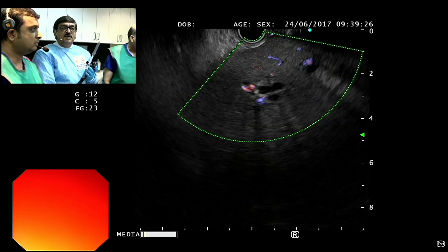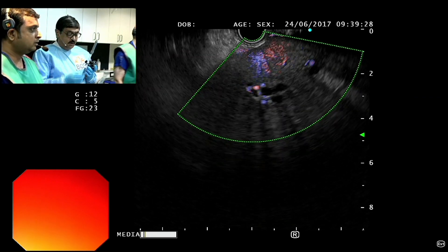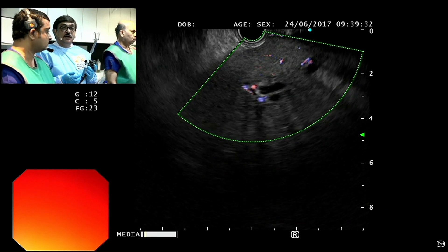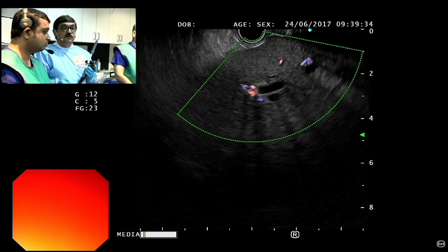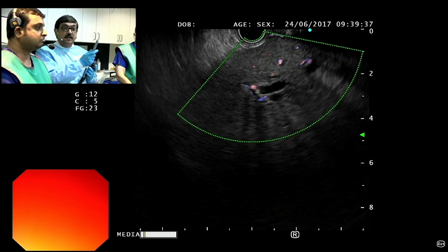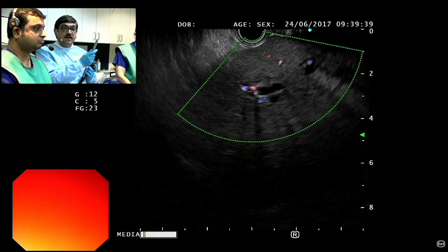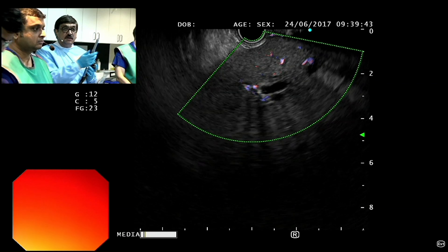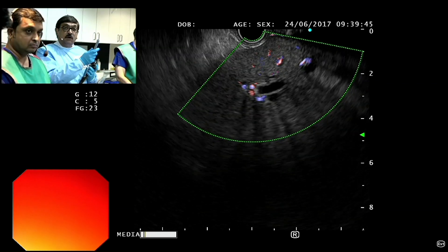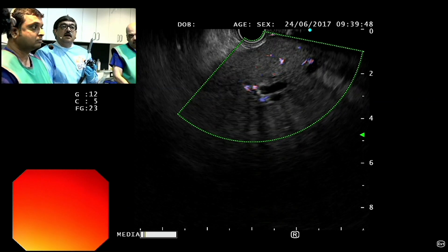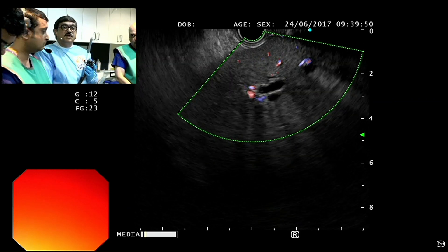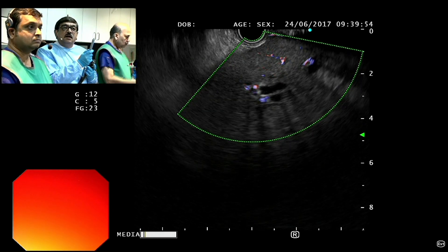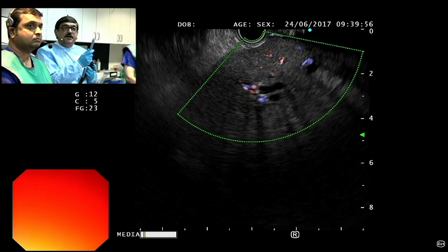The advantages of US-guided biliary drainage is that you can approach the biliary system from multiple routes — from the liver, from the duodenum. In this case, we have both sides available: the duodenum as well as the liver side. So I am trying to attempt first from the liver, and then we will see. If we succeed, we will show you the antegrade procedure.